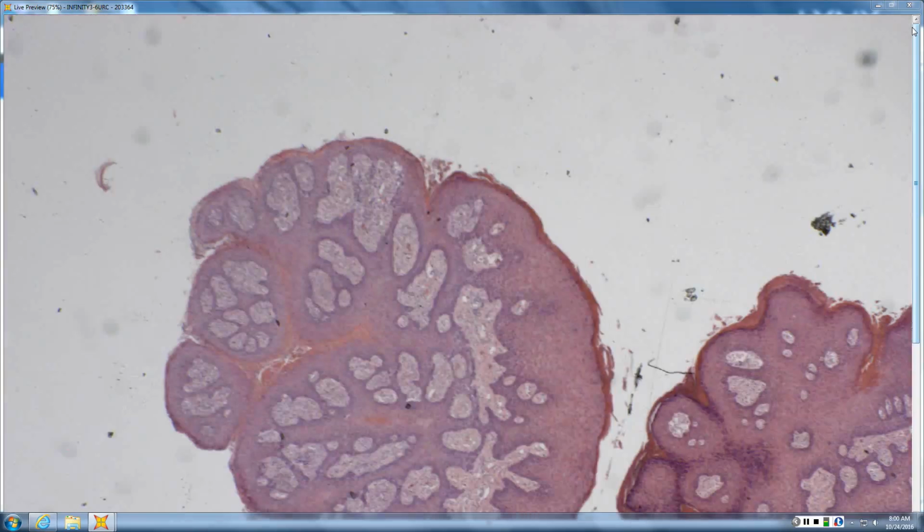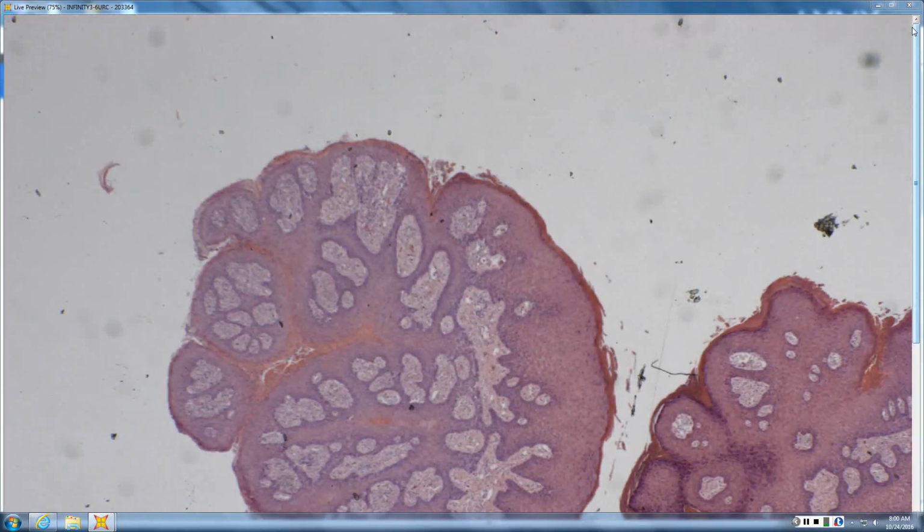The ones in the mouth are thought to be a papilloma of some sort. The ones in the genitalia are usually thought to be venereal warts clinically. There is no association of HPV with these. And histologically, what you get is a bump. There's usually hypergranulosis and hyperkeratosis because it looks warty. Your papillae are expanded with pale grayish pink stuff.